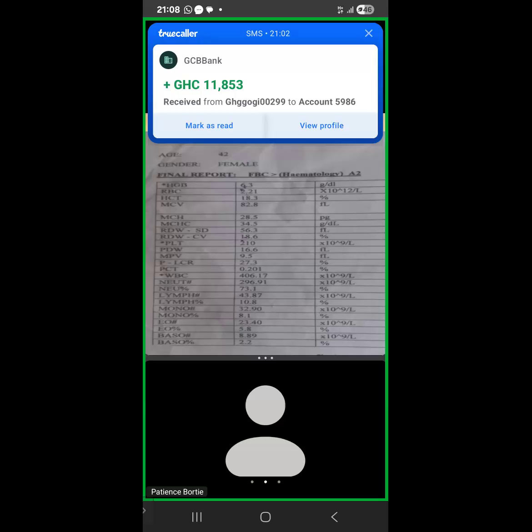When you examine the film, you expect to see if indeed there are retics. If indeed there are retics, what on full blood count would you see that will tell you there are retics? A lot of retics. I think the histogram will help with that.